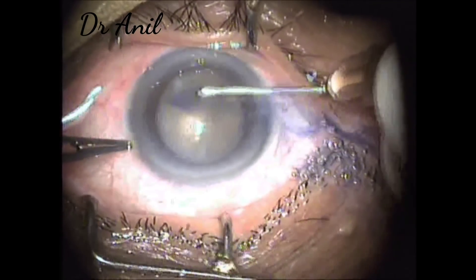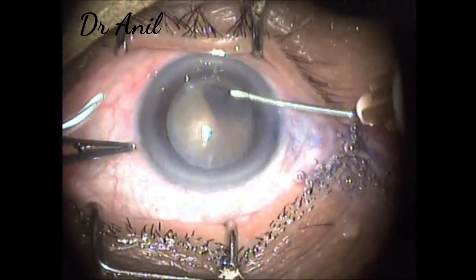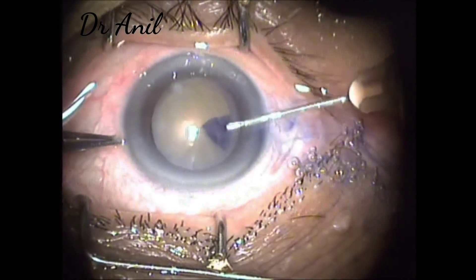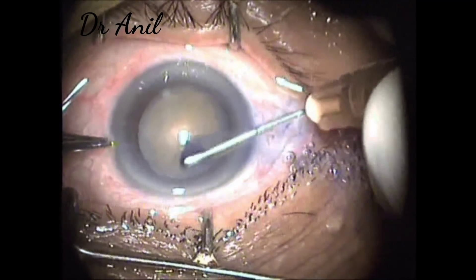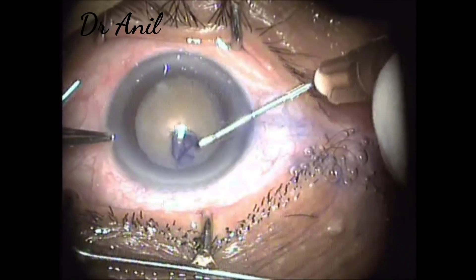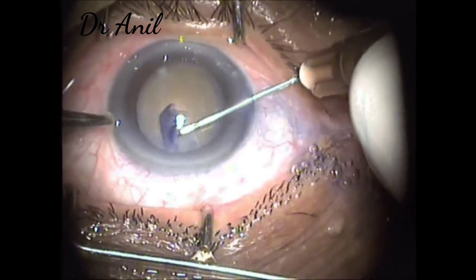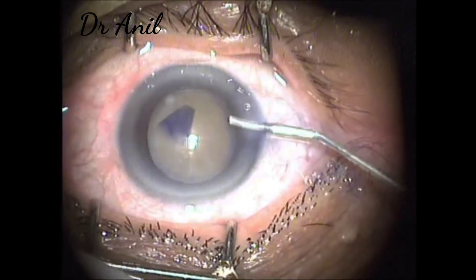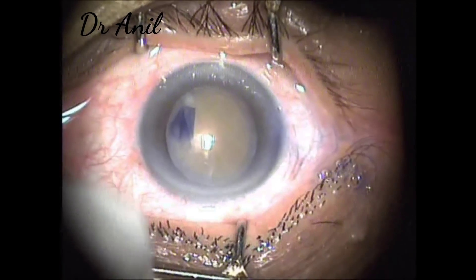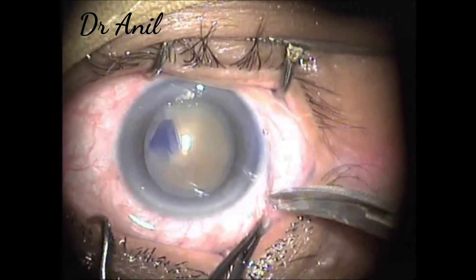The flap is raised and it has been completed, just guiding the margins of the rhexis and the pupillary margin so that it remains in vision, going all through in a circular manner and completed in an outside-in manner. The rhexis is now complete, and the chamber is filled a little more with viscoelastic so that the formation of the scleral tunnel becomes a little easier.